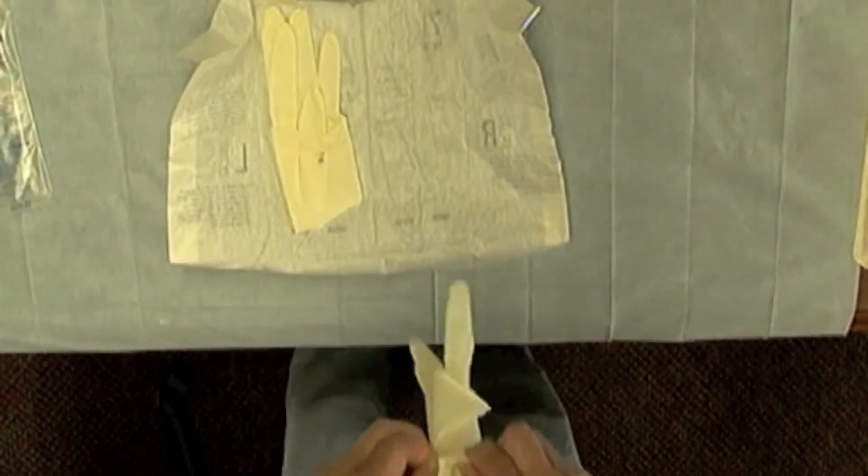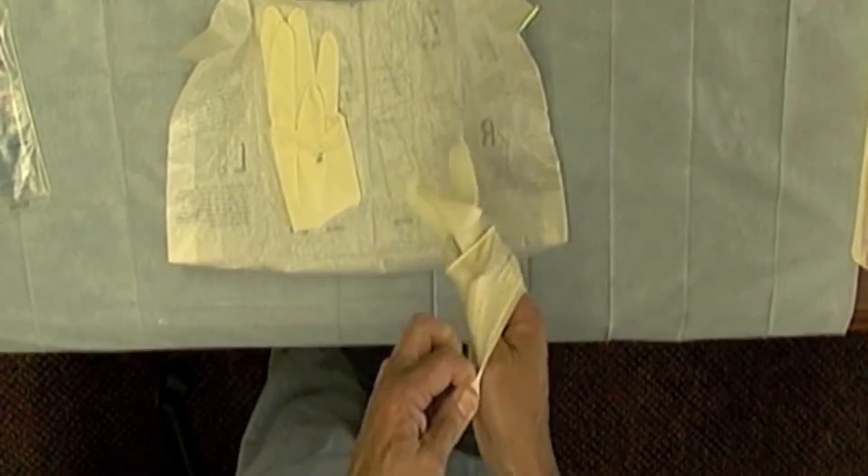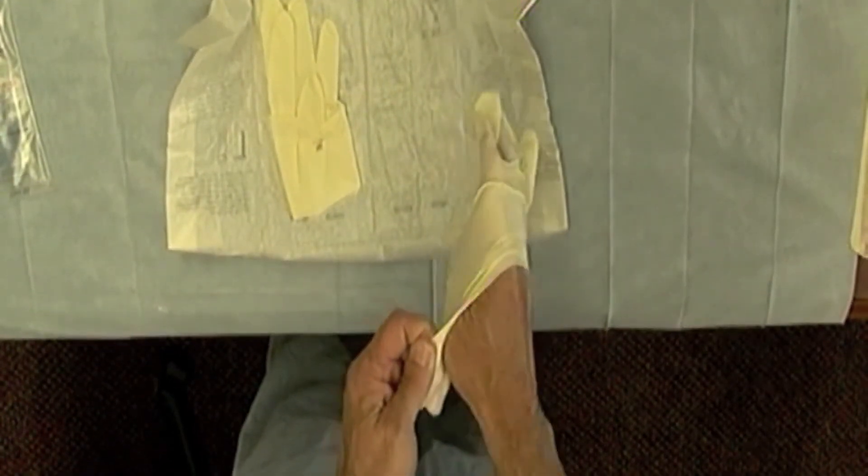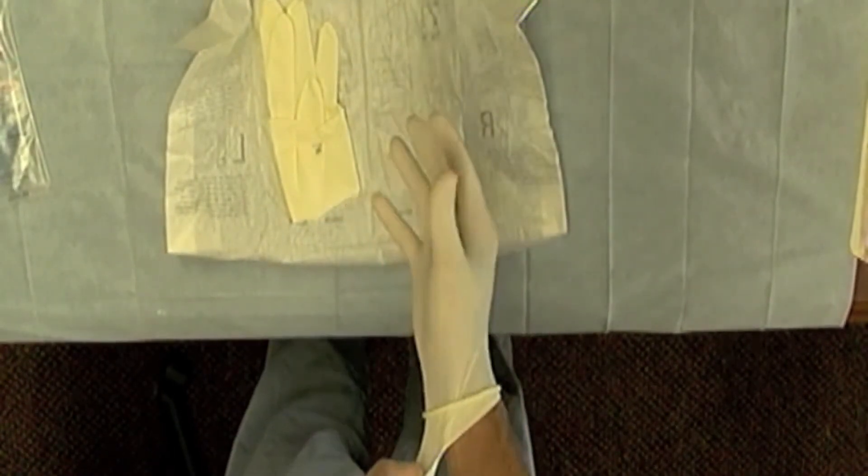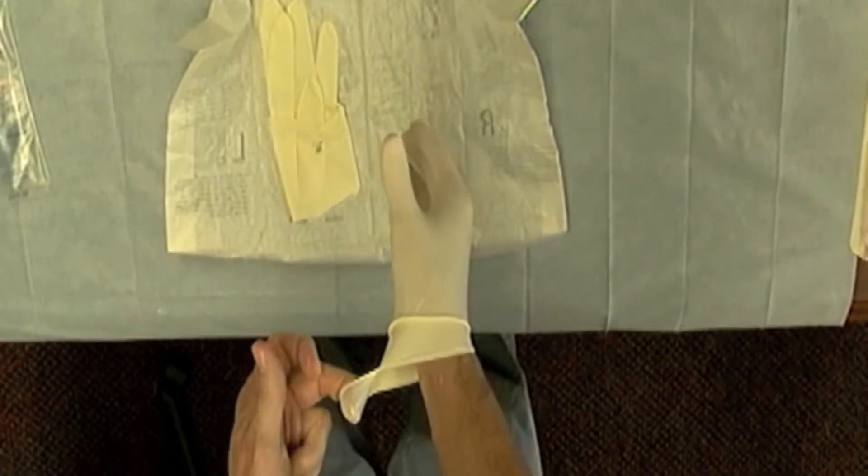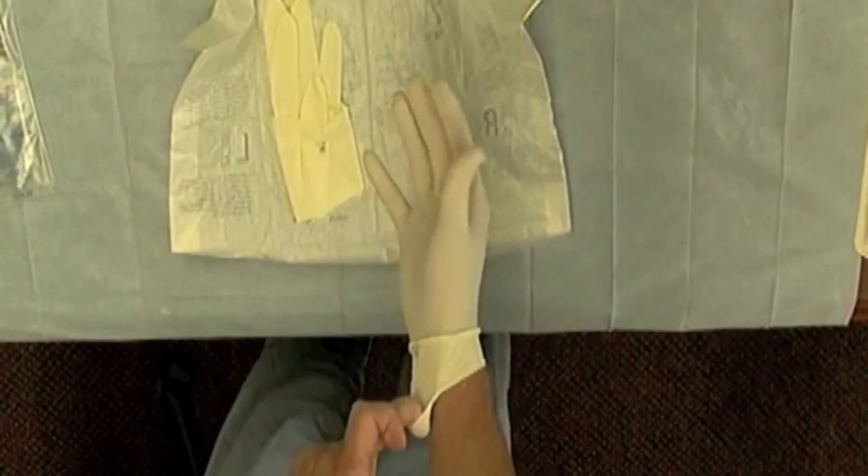Now I'm able to grab this glove and carefully insert my right hand into the right glove using my left hand, which is obviously considered non-sterile, on the inside of the glove.